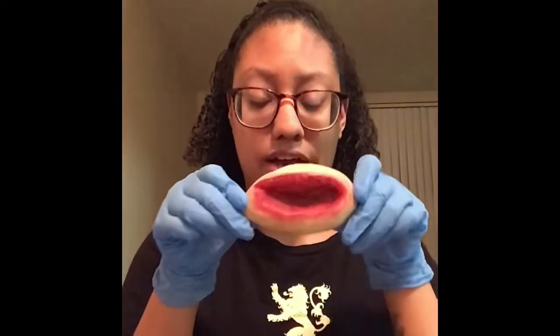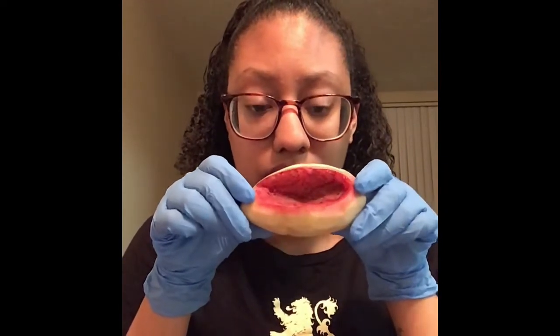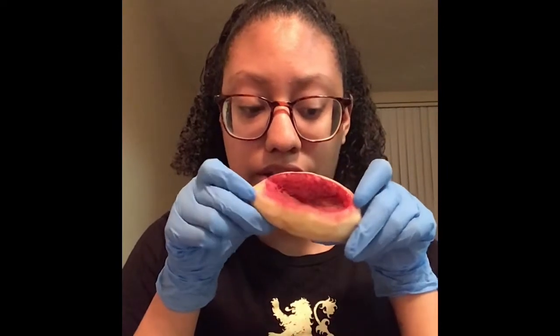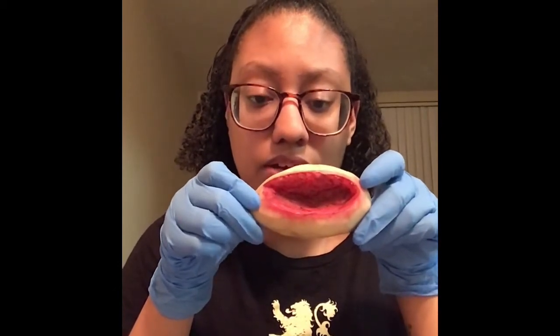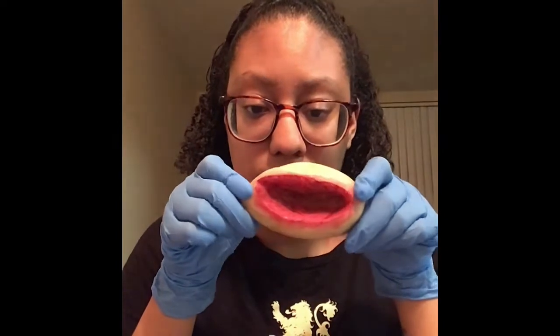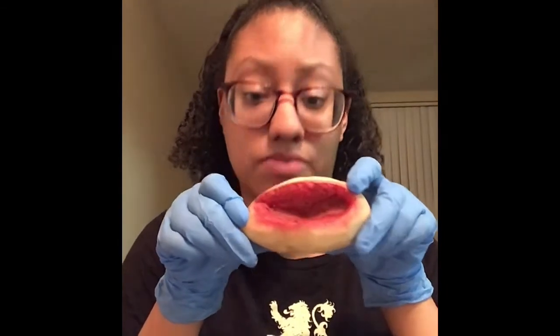When removing the dressing, you want to be looking at color, odor, consistency, and amount of any drainage that may be present. After we remove our dressing, we are also going to look at our wound. We are going to look at the peri-wound area, and for this patient we would say that there is some erythema going on here. We would also look at the bed of the wound, and we would note that that is beefy red, and we see some granulation tissue going on, which is a good sign of healing.